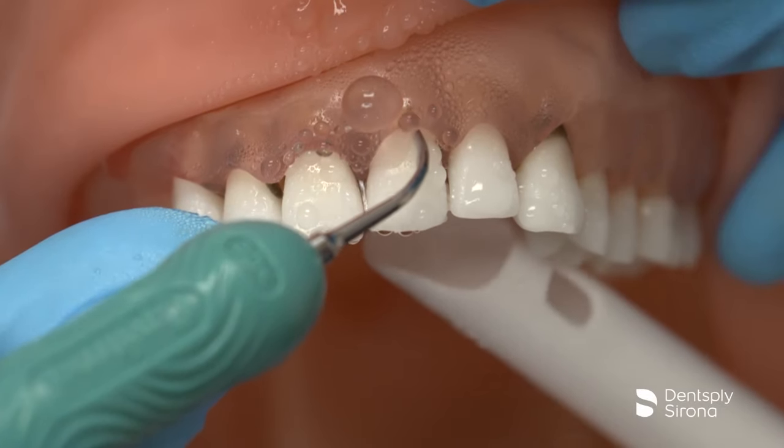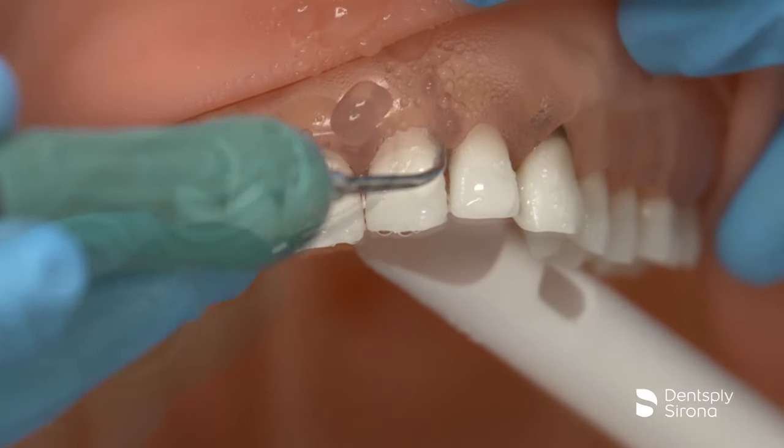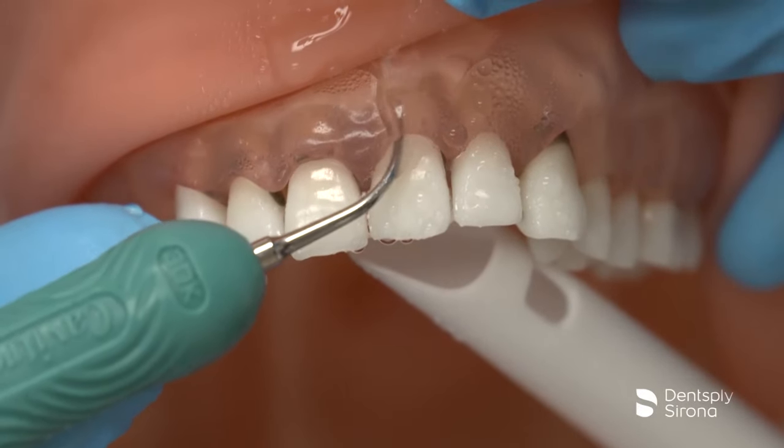Haphazard strokes will leave the surface incomplete, contaminated, allow for biofilm to attach, and harbor the pathogens we are attempting to rid from the pocket.